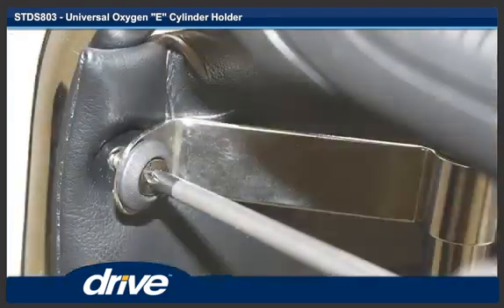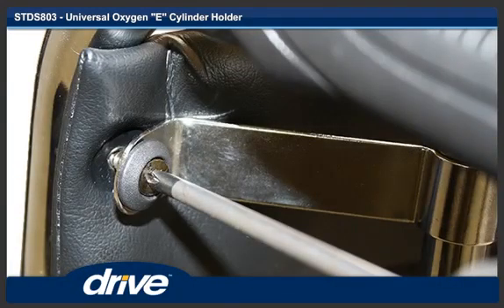Step 7. Insert the backrest screw through the offset bracket and reinstall the screw into the chair.